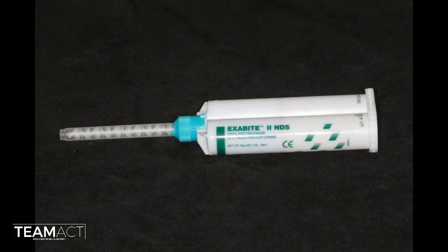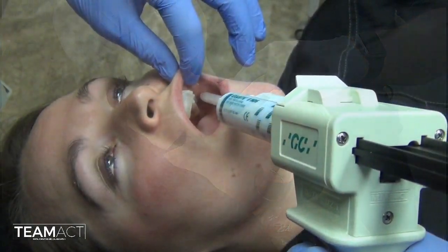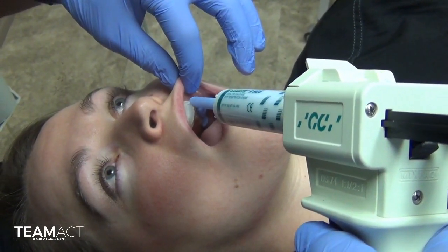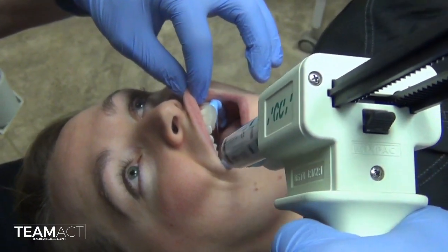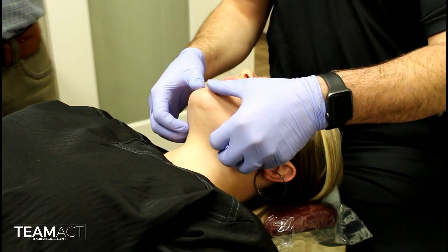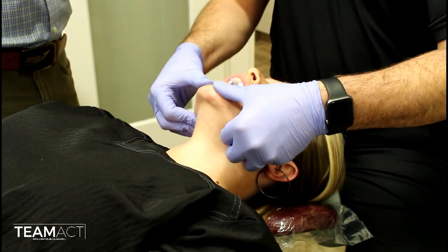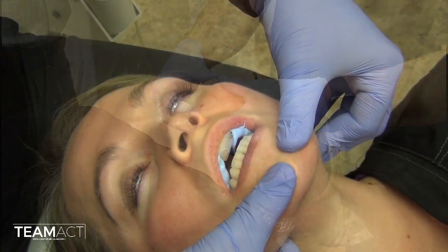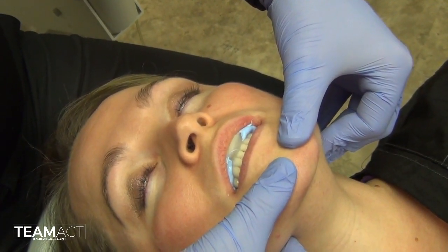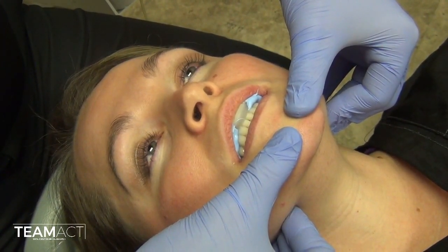Now that we have created that jig, leaving it on her teeth, I will inject GC Exabite material. You really want a rigid material with minimal distortion onto her maxillary teeth. Occlusal surfaces are covered to a thickness that allows recording of the occlusal surfaces of the maxillary and mandibular teeth. Placing my thumbs on the chin and my fingers on the inferior border of her mandible, I guide her as she closes into that jig and retain that position until the material sets up. This material takes about 35 to 40 seconds to fully set.